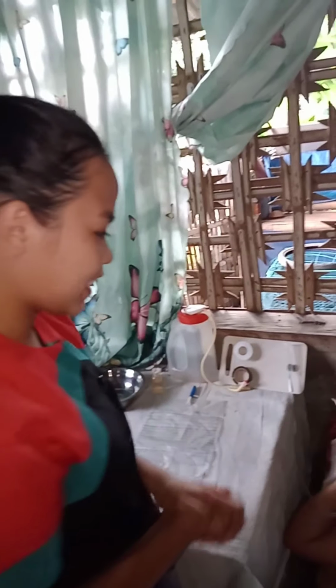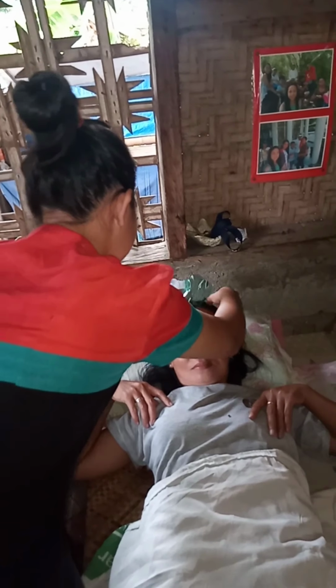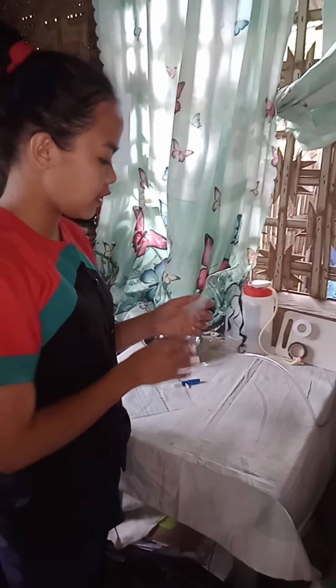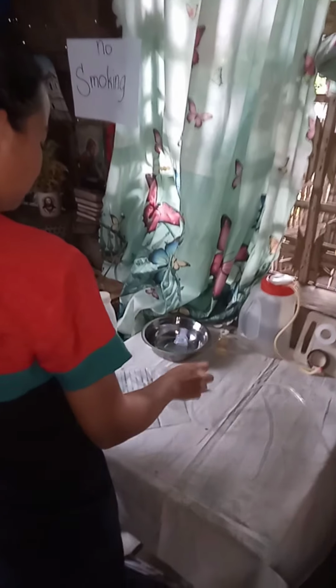Then after that, let's proceed to the rebreather mask. For the rebreather, we don't need the valve, and we really need to get this connector piece because we don't need this anymore.